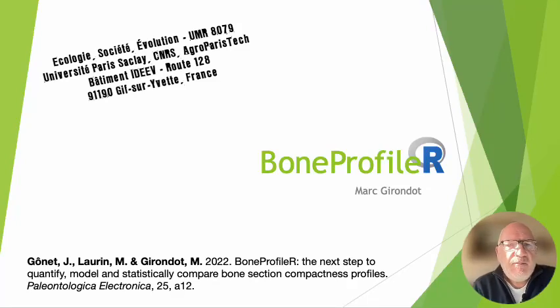Hi, I am Marc Girondot, and I have produced a software named BoneProfileR in collaboration with Jordan Gônet and Michel Laurin to help researchers to analyze bone section. I have made this little video to explain in more details than what we have done in publication, some particularities of this method and the software.